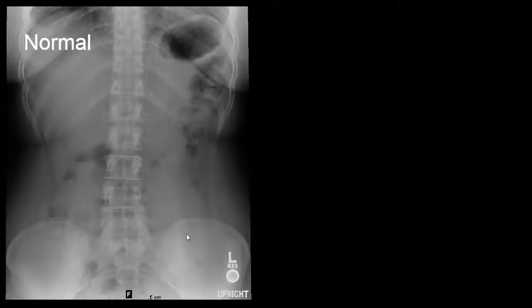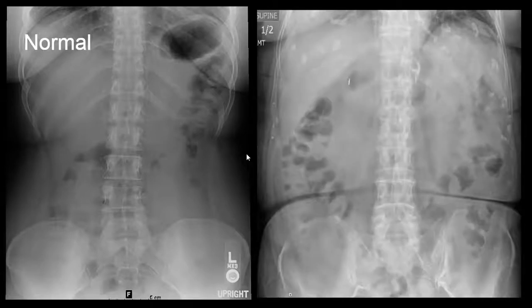This is an example of a normal abdominal radiograph. We look at air, bone, soft tissue — and this is an example of normal.